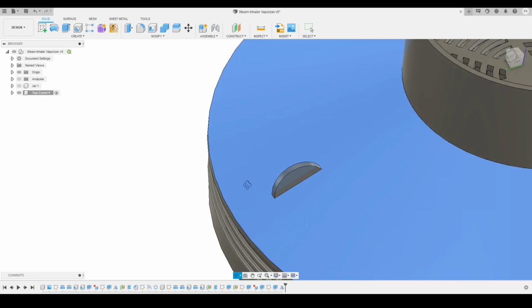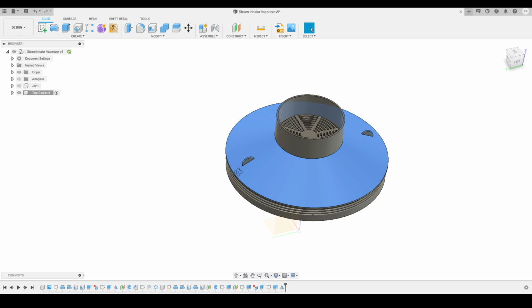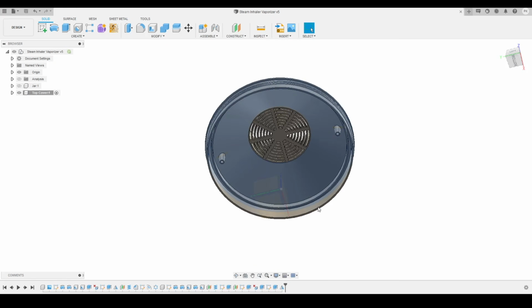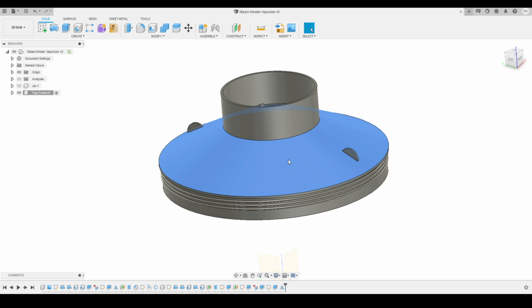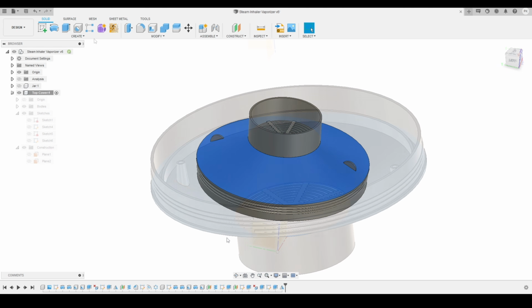Just two clips here to hold and rotate this top cover piece. And if I show you from the bottom, before that I will just save the file. So if I show you from the bottom, the knob that we had created on the bottom has also got mirrored on the other side. So this is the piece we had created so far using all the tools that we get inside Fusion 360. So we move on to creating our next feature now.